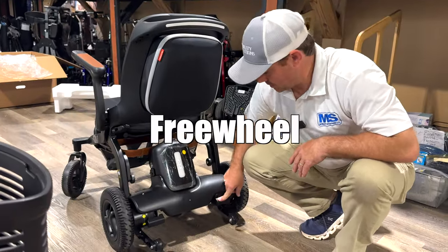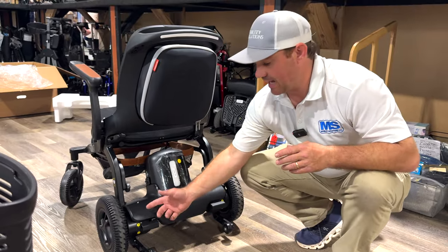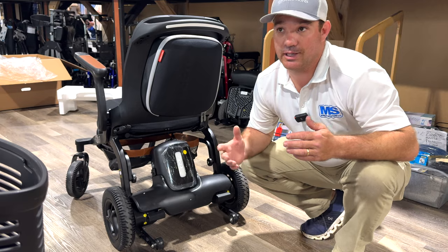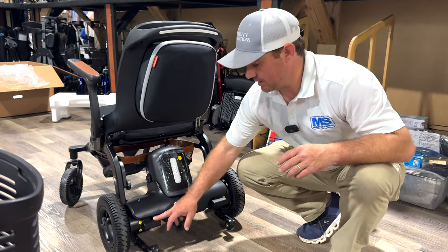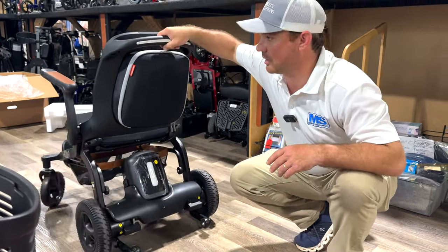Here's your brake system. So in order for this to operate, you've got to have this in the up position. If you want to roll it, for some reason it dies, or you're getting to a tight spot or overcrowded place, and you want to push the person in it, push those down, now you can push it. It has a nice little handle right here.